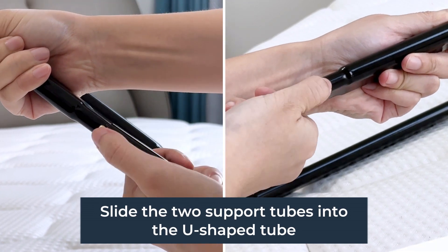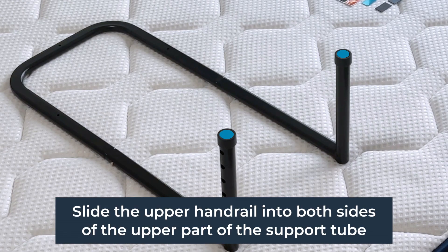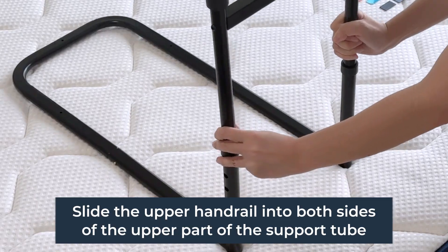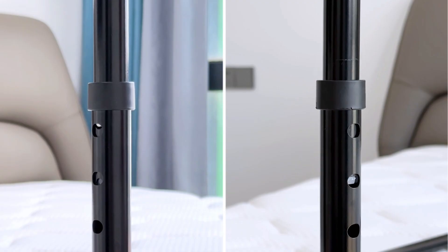Step 1: slide the two support tubes into the u-shaped tube. Step 2: slide the upper handrail into both sides of the upper part of the support tube and press down until it snaps.